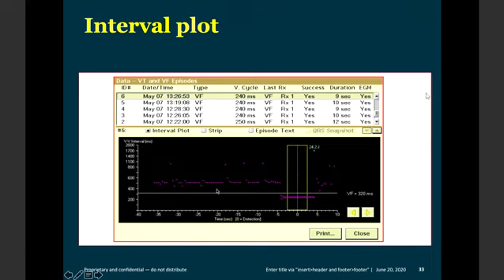And if you can see these intervals here, they fall at a rate which is lesser than the ventricular fibrillation rate. You see, suddenly the rate has increased or the cycle length has decreased to the VF zone that you see here. And this device rightly classified it as a ventricular fibrillation, delivered a 24 joule shock, and the arrhythmia has been converted because you see these dots here, they have come above the line.